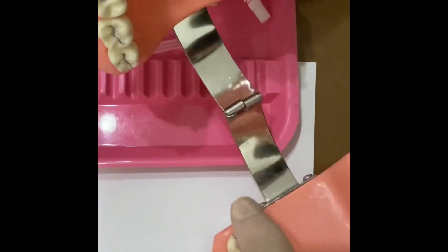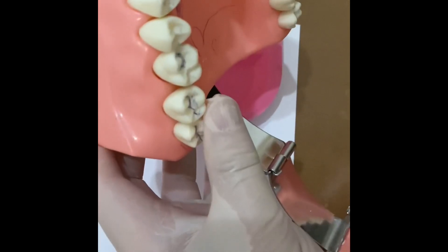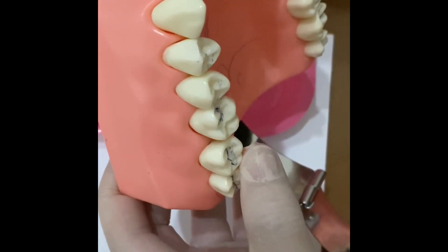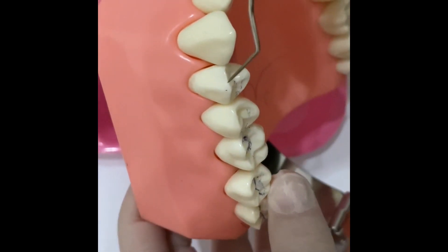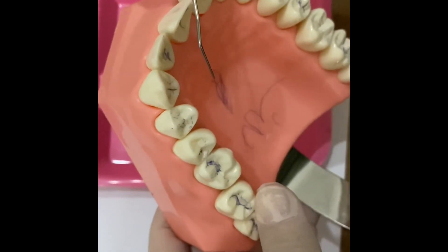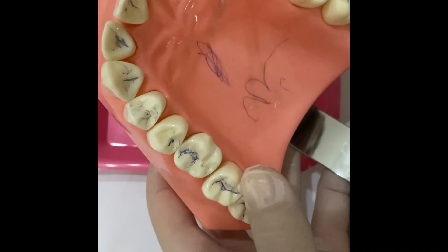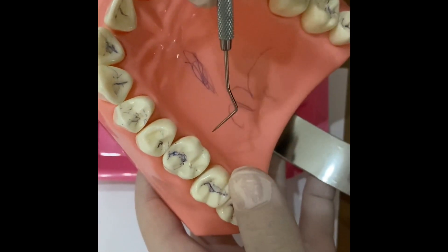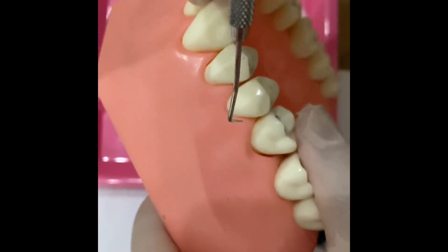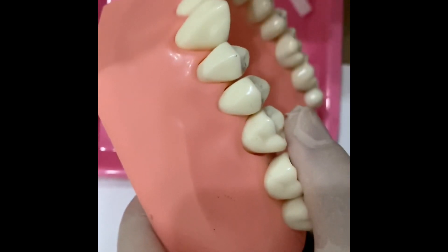If you want to do operative work in the upper jaw, we give anesthesia as infiltration in the area adjacent to the tooth we want to treat. If you want to do a surgical procedure, in addition to the buccal infiltration, we should give palatal anesthesia. The palatal anesthesia can be given directly in adults, while in pediatric patients we should use the intra-papillary technique, which we will show soon.